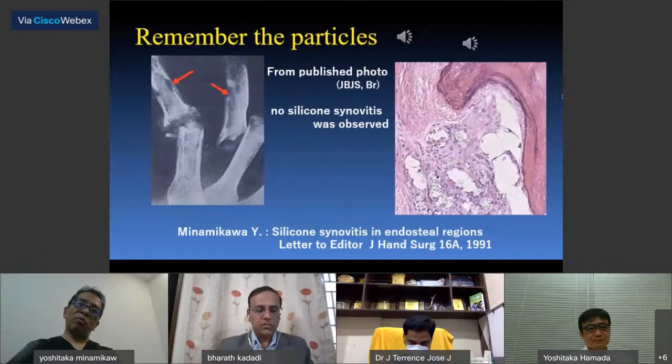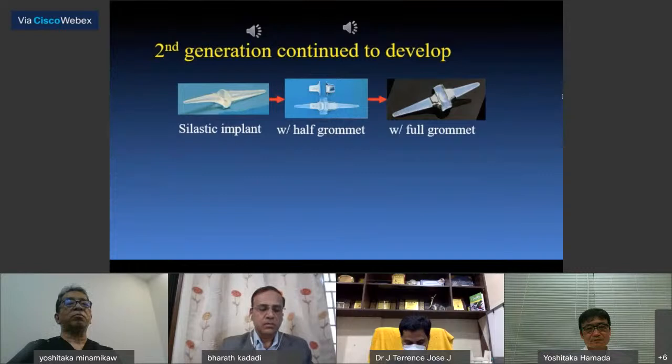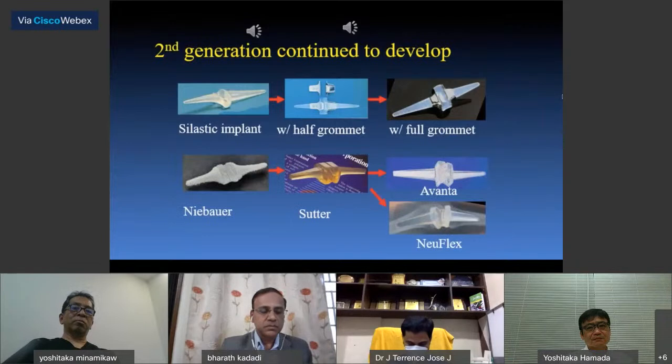Only silicone implants continued to develop. The Swanson implant has changed material several times, used half grommets to full grommets, and is still one of the most popular finger implants ever used. The Niebauer attempt to attach to the bone using Dacron mesh succeeded, but the result was a high fracture rate at the hinge. However, this design continued to Sutter and Avanta and also to NeuFlex.